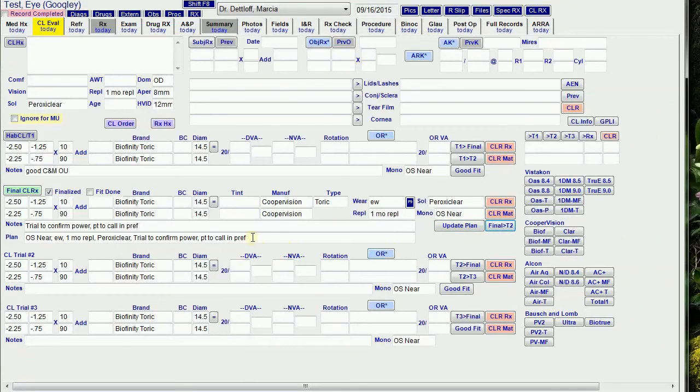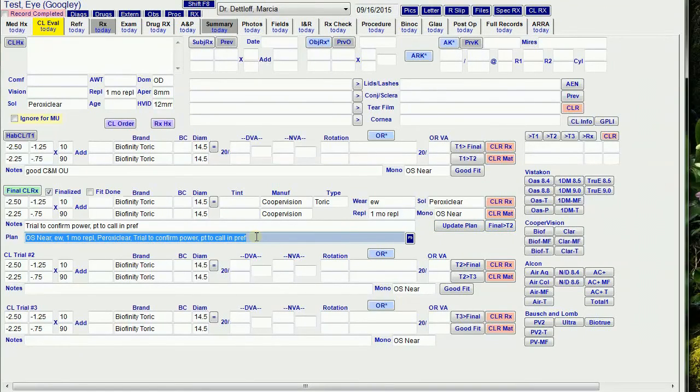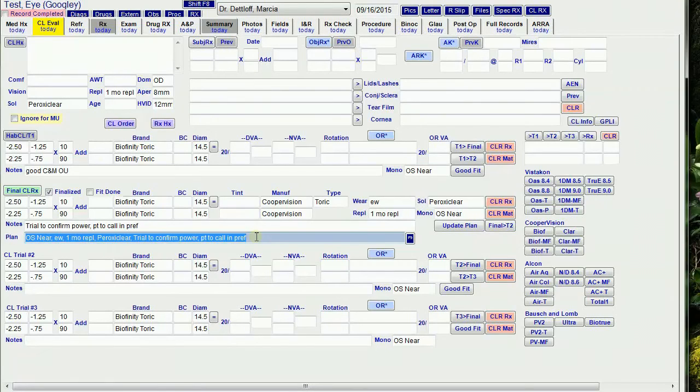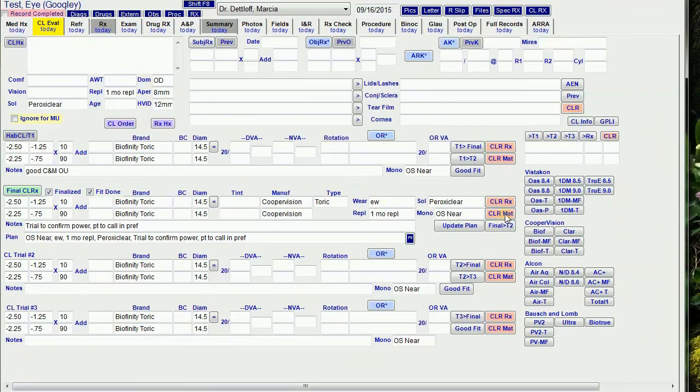Then I add a dated update in the notes that says the patient's preferred the original lenses, then I update the RX and finalize it. The clear material and clear RX buttons in the final RX work a little differently.